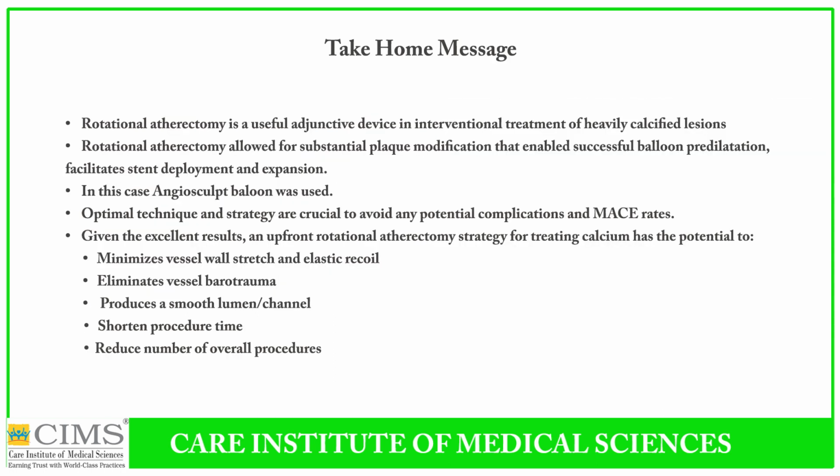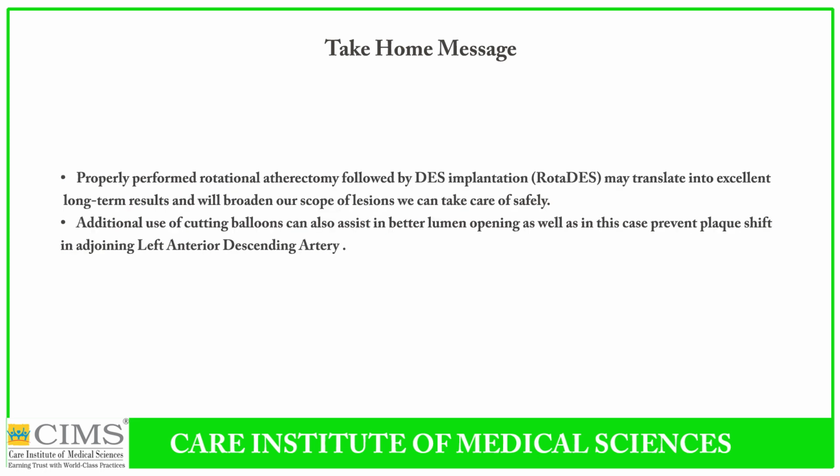So my take home message will be rotational atherectomy or orbital atherectomy is a useful adjunctive device in interventional treatment of heavily calcified lesions. Rotational atherectomy allowed for substantial plaque modification that enabled successful balloon pre-dilatation. In this case, an angiosculpt balloon was used to supplement, which gave even more optimal treatment without plaque shift, minimizing vessel wall stretch, eliminating vessel barotrauma, producing a smooth lumen channel, shortening procedure time, and reducing overall procedures.